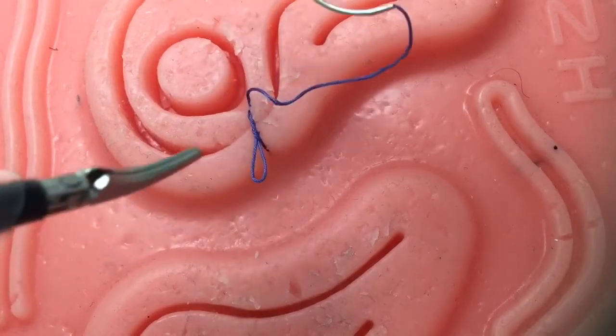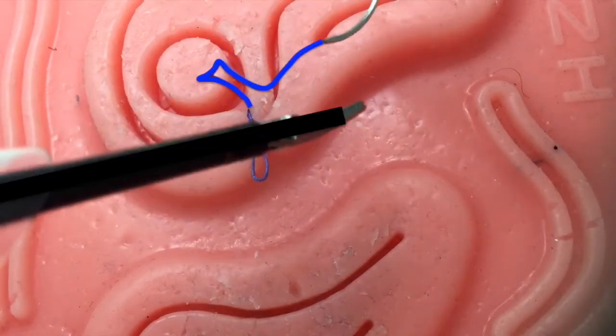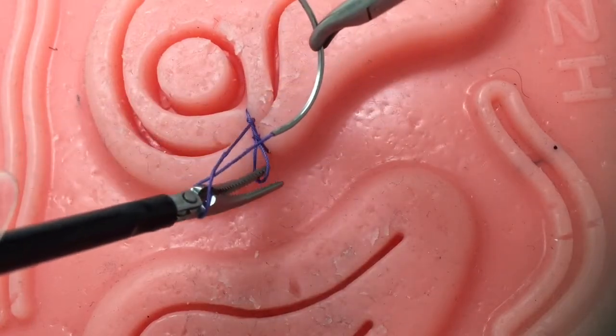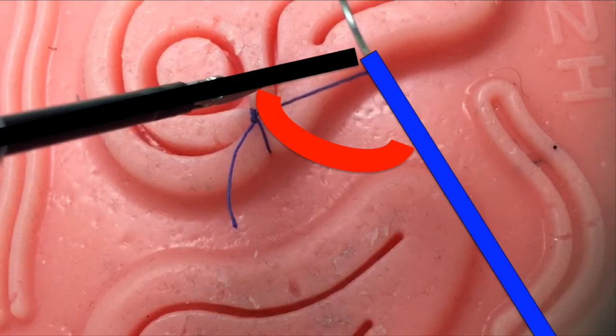Remember to alternate your throws by placing your left instrument on opposite sides of the suture. And again, always rotate the needle to line up with the suture to minimize the instrument-to-suture angle.